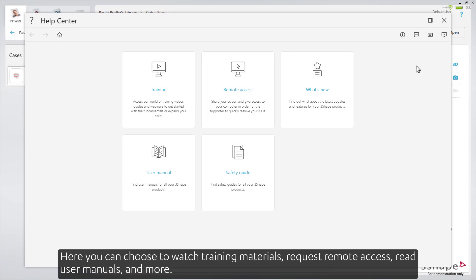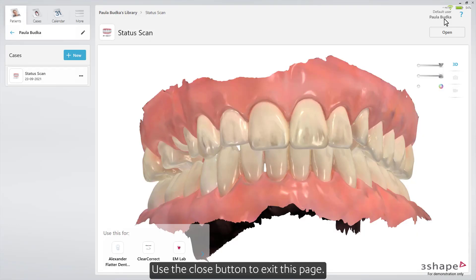Here, you can choose to watch training materials, request remote access, read user manuals, and more. Use the close button to exit this page.